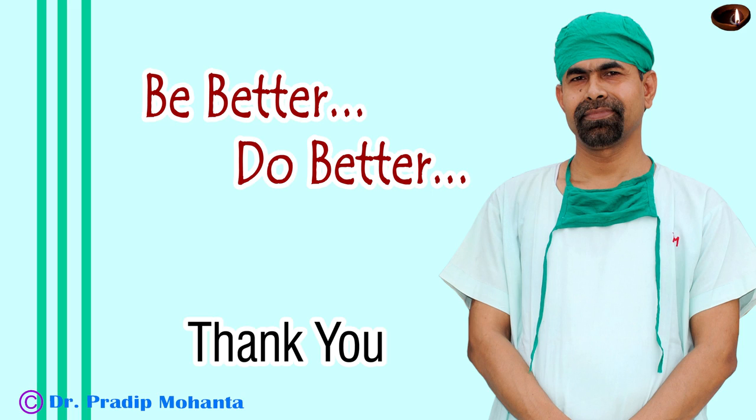Thank you very much for your attention. Hope this video will help you in developing your surgical skills. Please use a pupil expander in small pupils — it is very safe for the patient, safer than not using a pupil expansion device. Please be a very competent surgeon and serve your patients with love, respect, empathy, and great surgical competence.